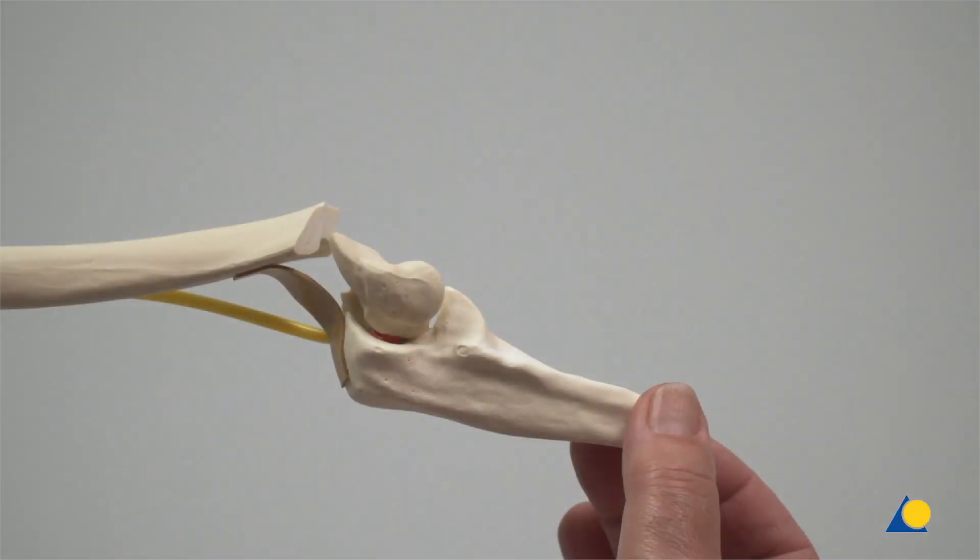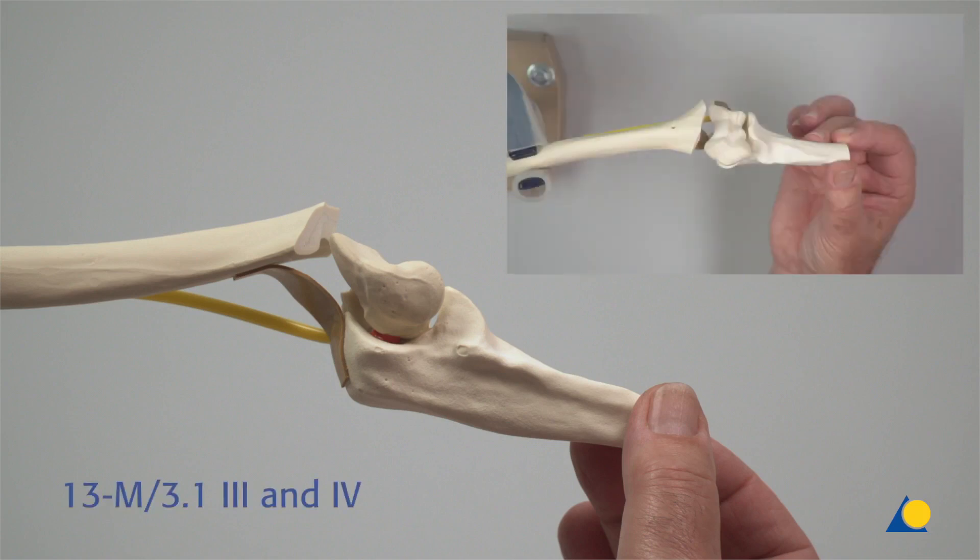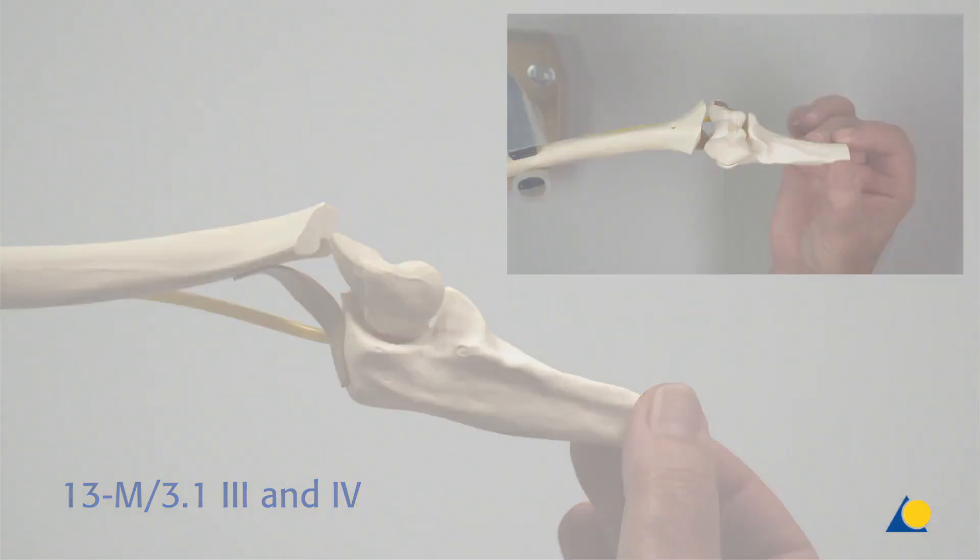The bone model shows a simple oblique extraarticular fracture, AO OTA Classification 13-M/3.1 III and IV. It can be observed that the main fragment is connected to the ulna by the periosteum, the ulnar nerve is visible on the medial side, and it is an extension-type fracture. Note that the bone model used in this demonstration does not include the radius.